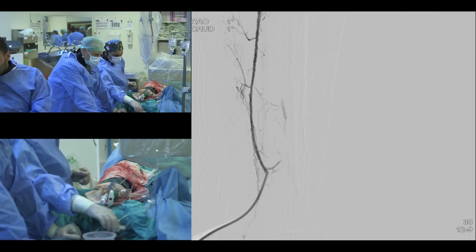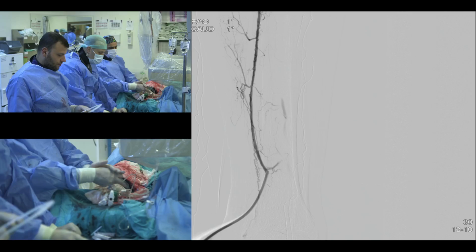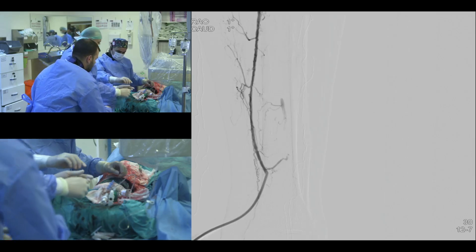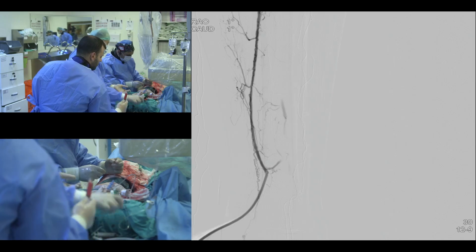I just did a case in Atlanta before I was flying back over here to Turkey. I had to fight with the hospital administration because each stent is $2,700, and since it was just approved, the hospital cath lab would not get it. But finally, we got it, and I will show you that case, a very interesting case.